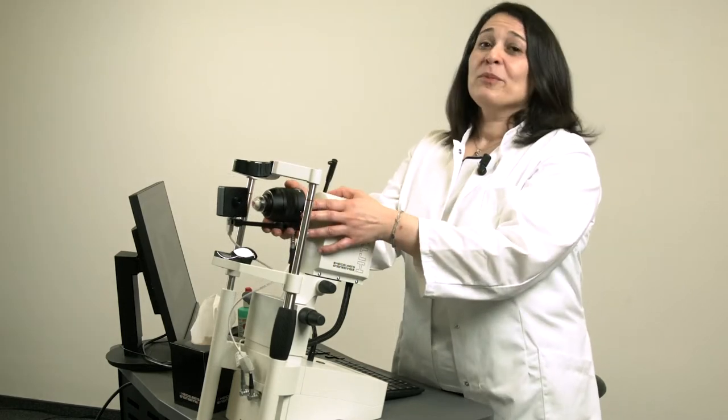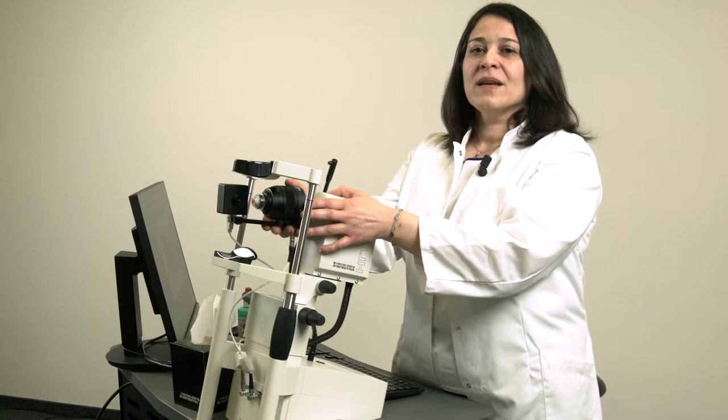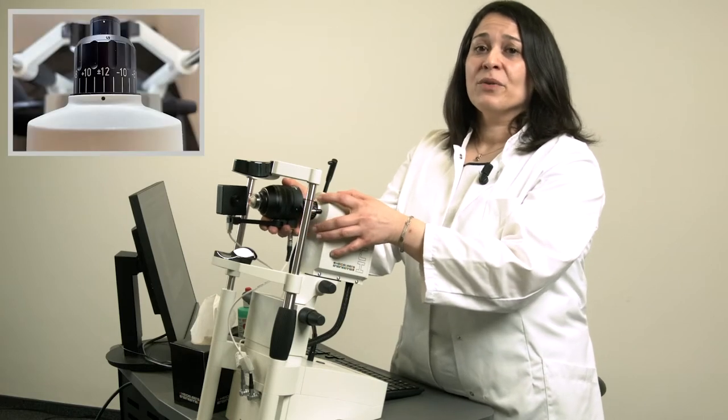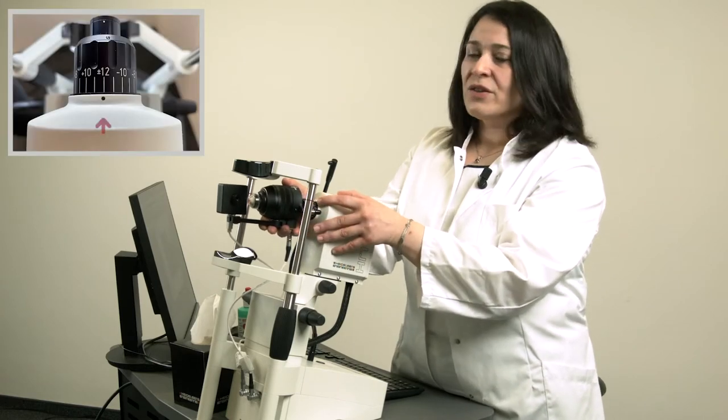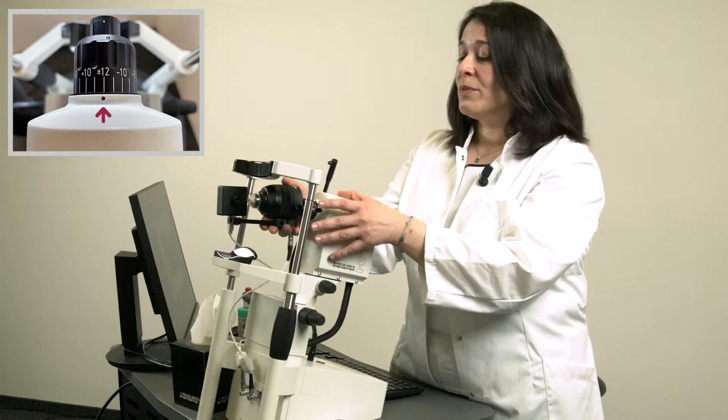Before mounting the RCM objective lens onto the HRT3 housing, please make sure again that the refraction on the HRT3 is set to plus 12 diopters.